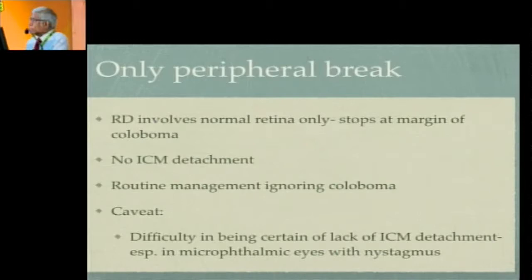But before we manage it as routine, we must be sure that there is really no intercalary membrane detachment. A small area of detachment at the margin can be easily missed in a microphthalmic eye with nystagmus.